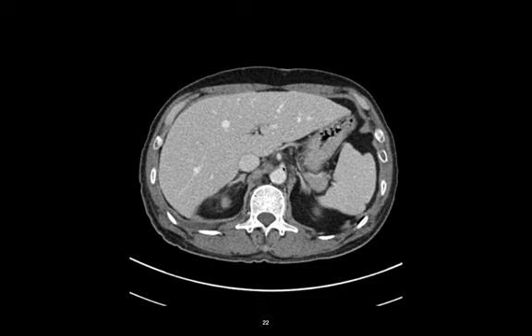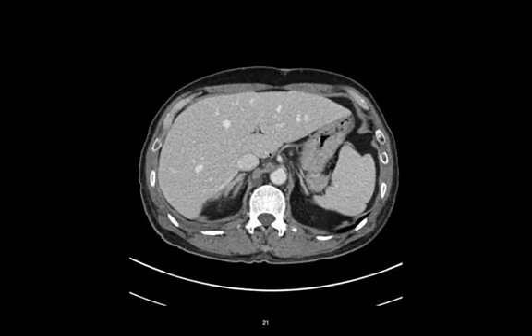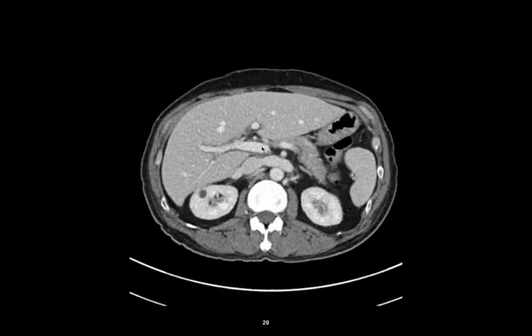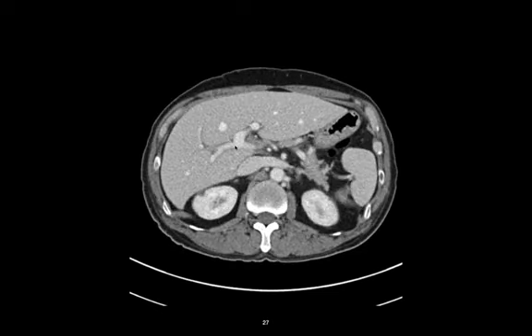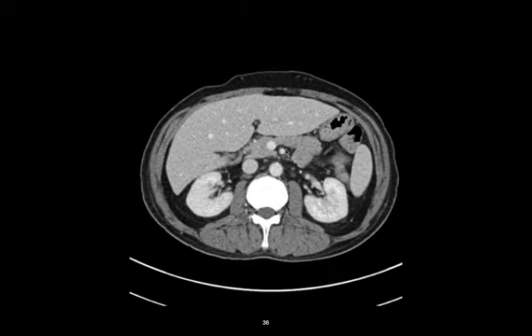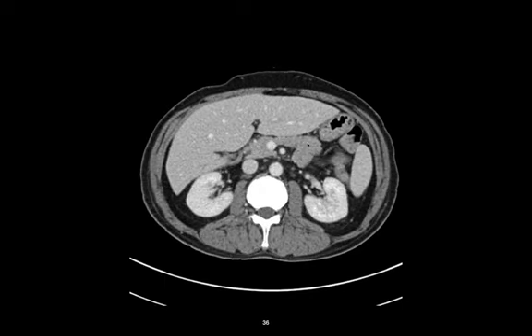And I also find my splenic vein. And how do I know where my splenic vein is? Well, let me find my portal vein, which is right here. And then I find the splenic vein, which is right there, and the splenic vein coming into the SMV, which then goes into the portal system. What you're going to notice is right where the SMV and the SMA are, the pancreas just wraps right around it. So there's our pancreas wrapping right around that. The pancreas, deep to the stomach.